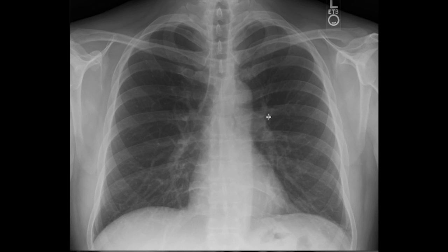These are the heart vascularity, and these small white areas, like a spider web appearance, are the lung markings. We call them lung markings. So lung markings have to be visible. This indicates that the radiograph has been exposed adequately and the correct radiation dose and exposure factors have been used. So that's about it for the evaluation criteria.